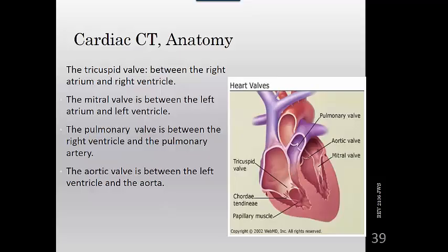So advances in CT and MRI are changing the established practices. Cardiac CT has emerged as a less invasive imaging modality for the diagnosis of coronary artery disease, or CAD. It's often used to avoid coronary angiography in low and intermediate risk patients in particular. Continuous improvements in CT detector technology and in temporal, which is speed, and spatial, which is thin slices resolution, has resulted in clinical results with cardiac CT that are similar to those with conventional catheter angiography.